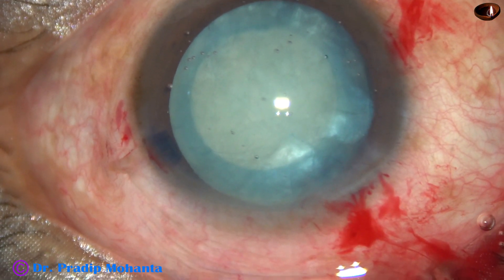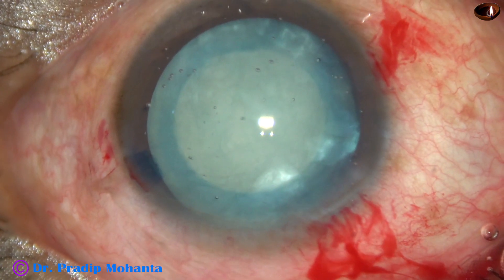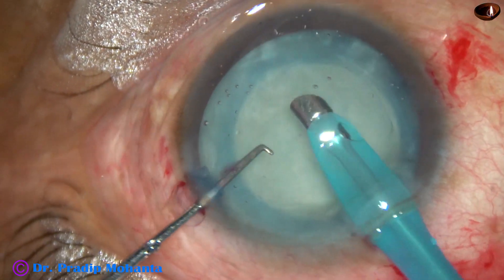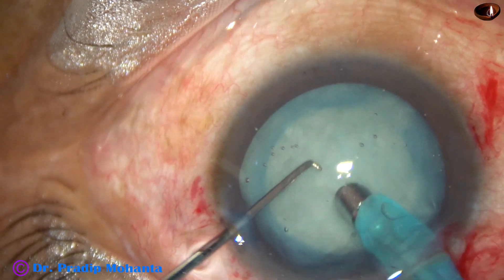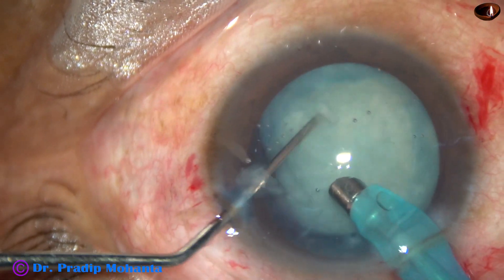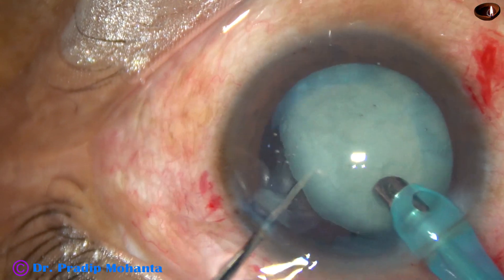And now it is time to manage the nucleus. Some more visco is added. The tip of the phaco needle goes in with its bevel down. As I try to remove some superficial cortical lens matter, I can make out that the lens is very, very soft. It is dangerous to bury the phaco needle in such a soft cataract.